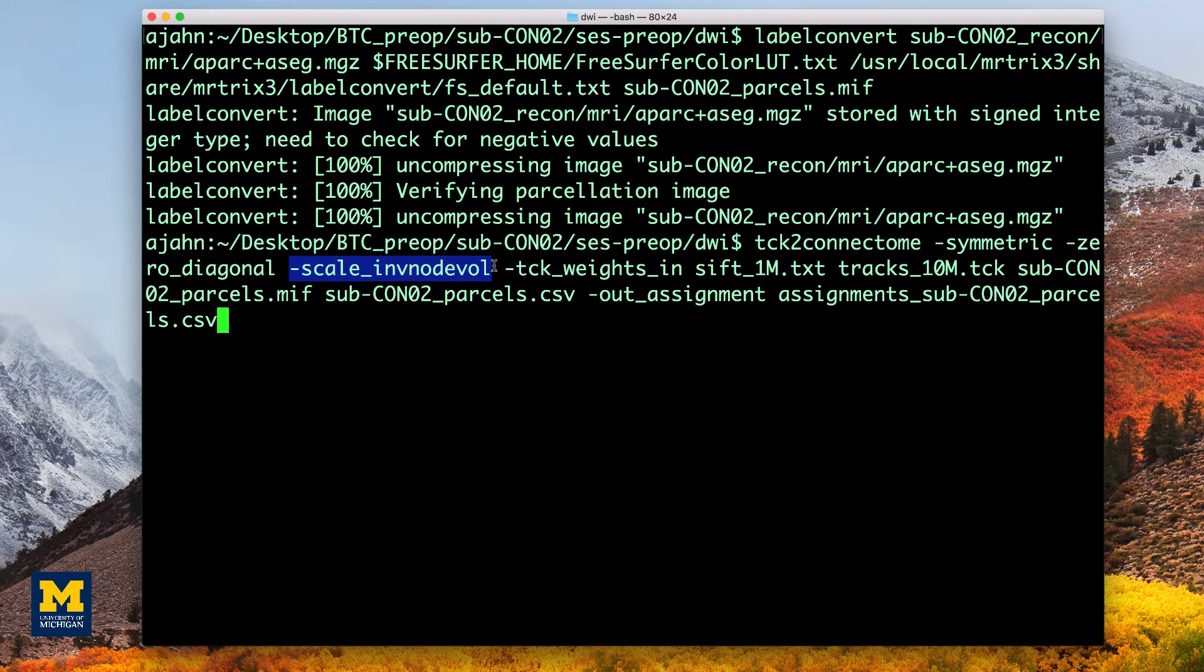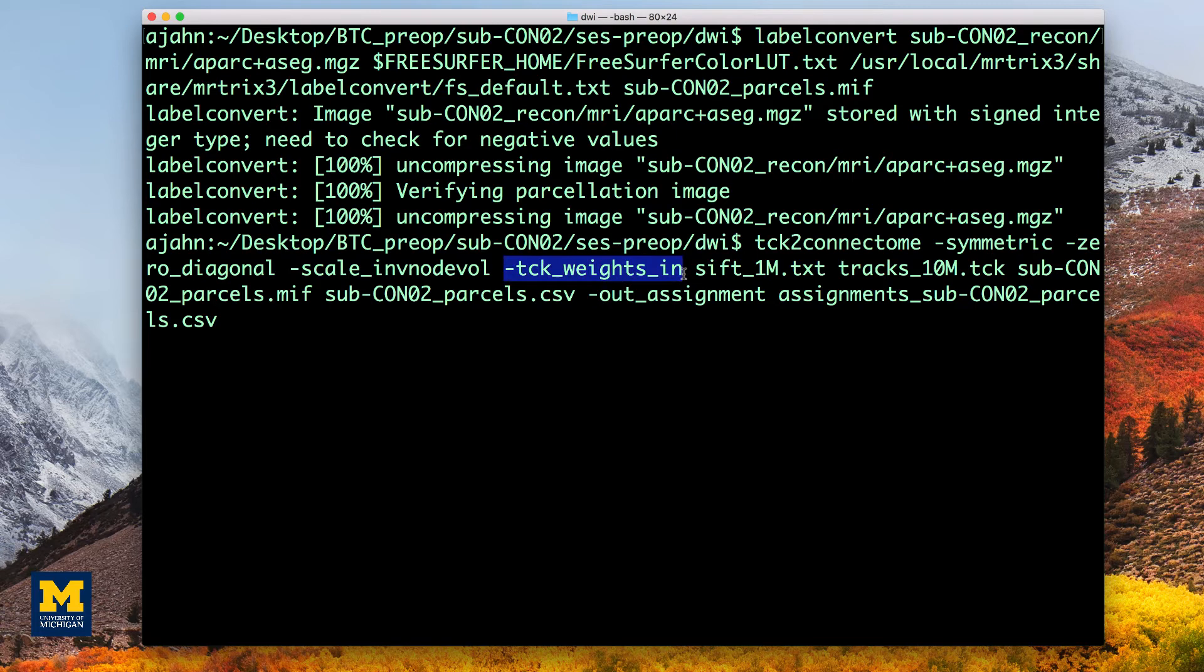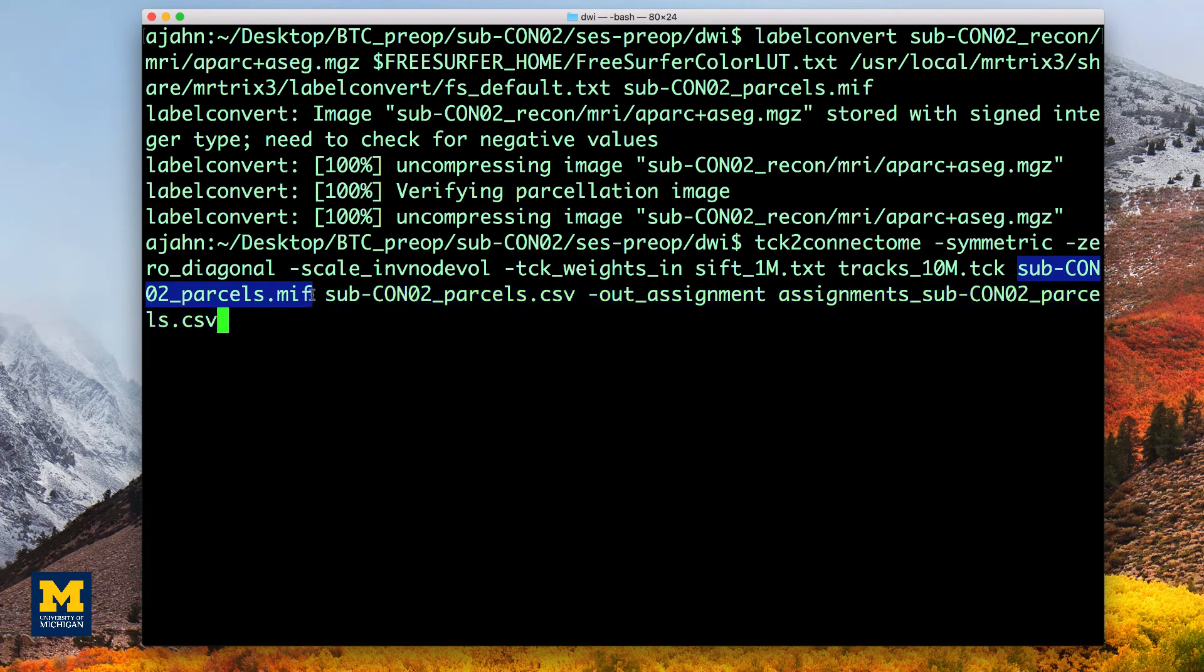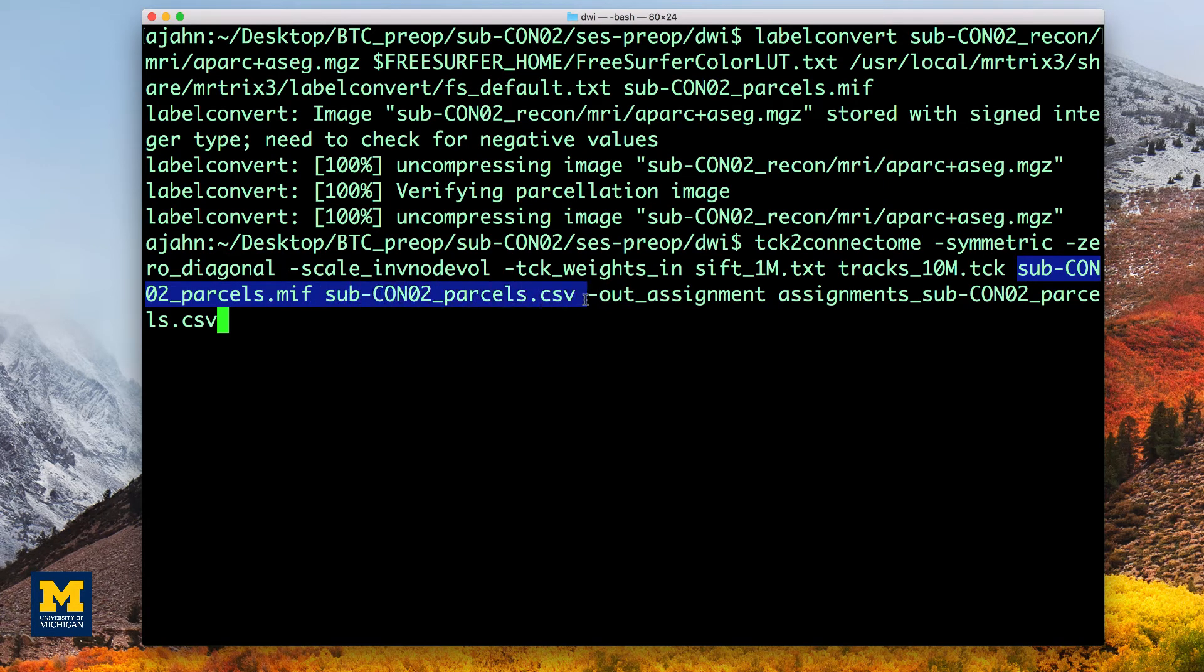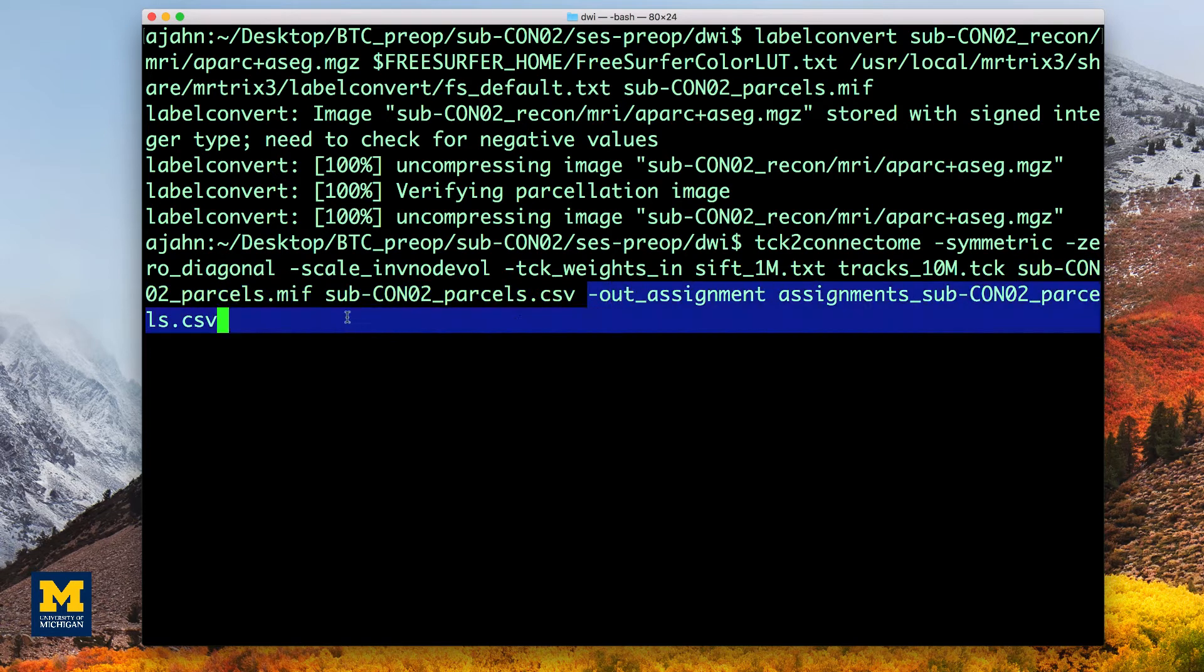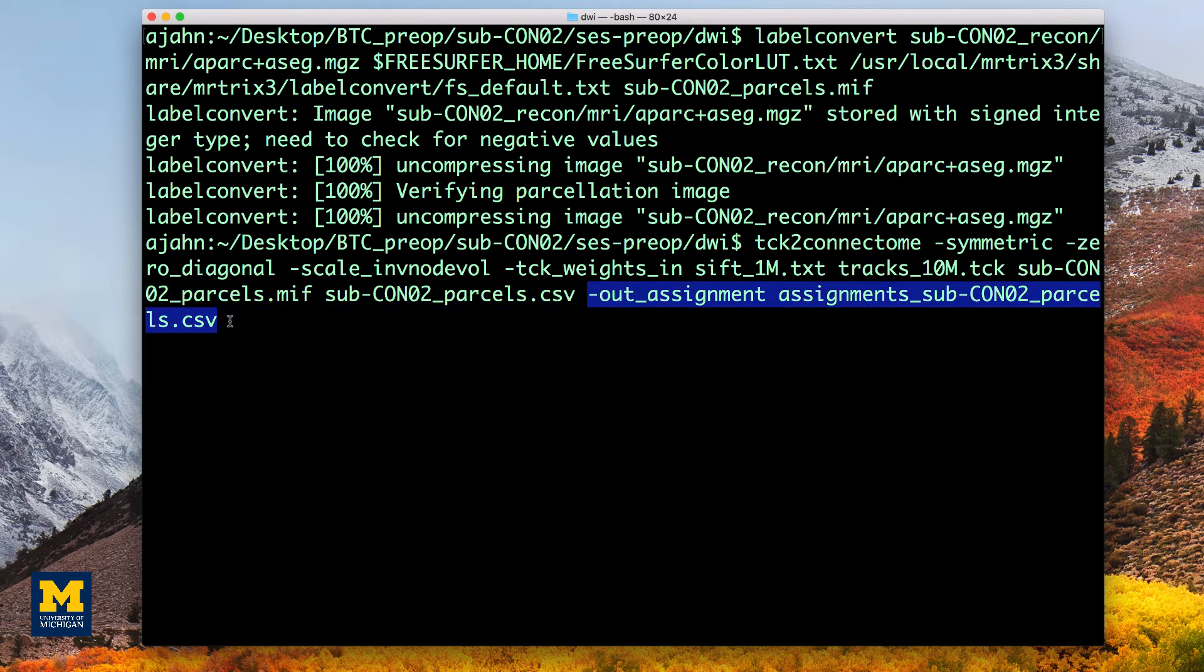The tck_weights_in will weight each connectivity pair by the output from SIFT, and the input will be the raw 10 million tracts that we created earlier. The parcels file that we just created will be converted to a .csv file that we can read into MATLAB. And out_assignments creates a file that can be used for the inverse operation of converting a connectome to a track if you want.